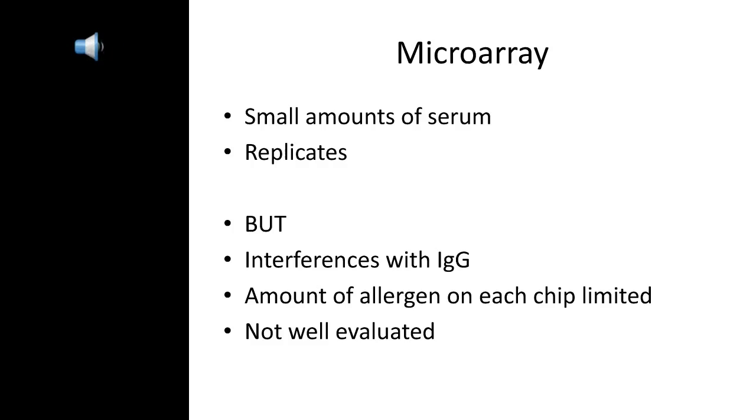So in summary, I want to say that there have been great advances in in vitro specific IgE allergy testing, and that component-resolved diagnostics does offer promise, but it hasn't solved all the problems. I took food allergy as an example, where it does improve the resolution of the comparison with challenge testing, but it's not good enough in terms of clinical practice, and we still have to challenge a lot of people, particularly if they're below that cutoff.